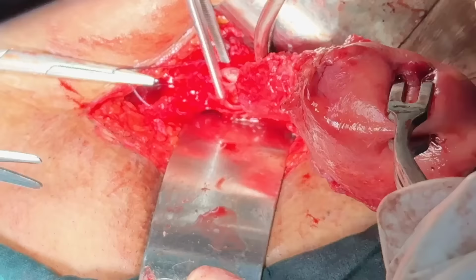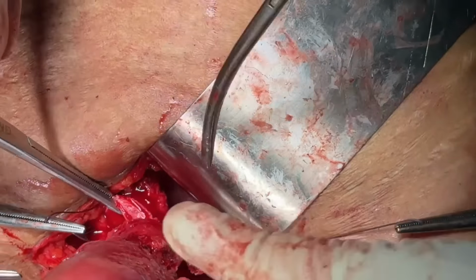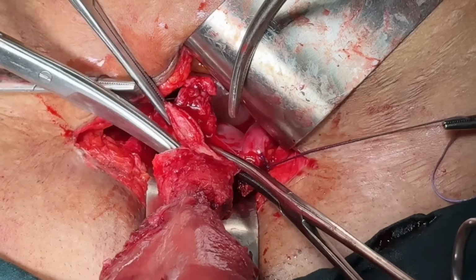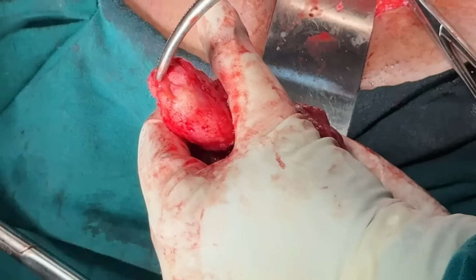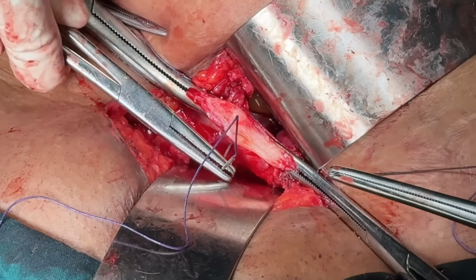Be careful, if the clamp slips, you need to hold it again. Remember that it has the descending branch of cervical artery, which is very important and can lead to hemorrhage in the post-operative period. Check this specimen to ensure that the entire cervix has been removed.